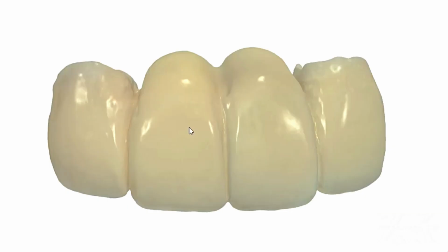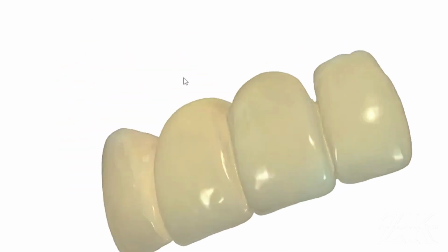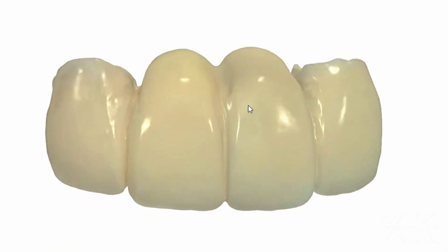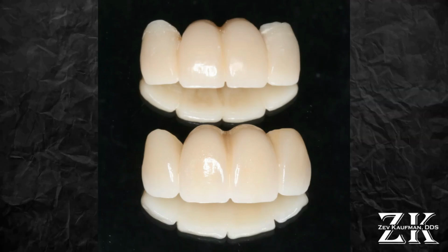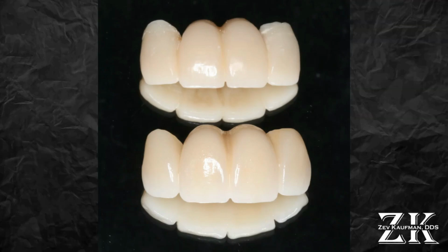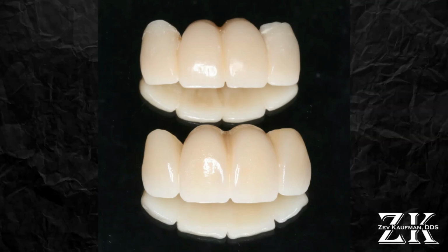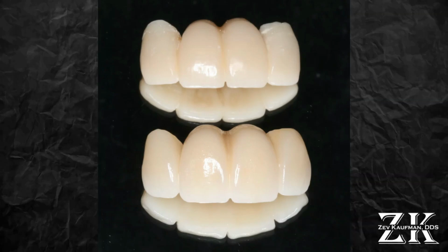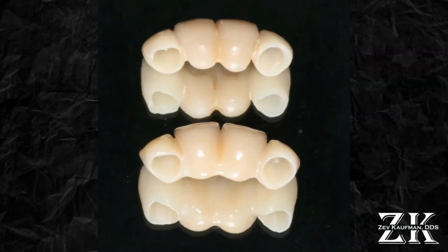And in order to help my technician visualize what needs to be created, I went ahead and scanned the provisional bridge as a guide as well. Take a look. You can see the rounded ovate pontics and the way the bridge is. It's beautiful. My technician managed to duplicate our provisional and create a beautiful final zirconia-based restoration with porcelain baked on top to show some shades and gradations and make it look natural.